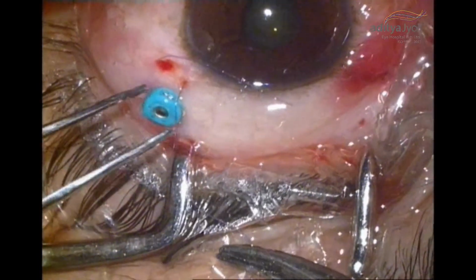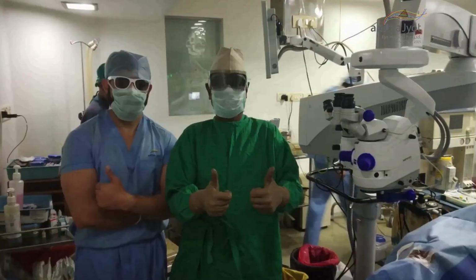And you can see the 25 gauge being removed, and that's the end of the surgery, done with the team with the 3D glasses on.